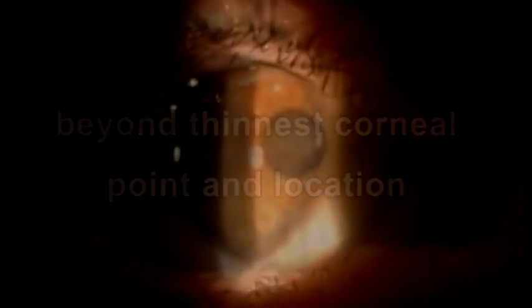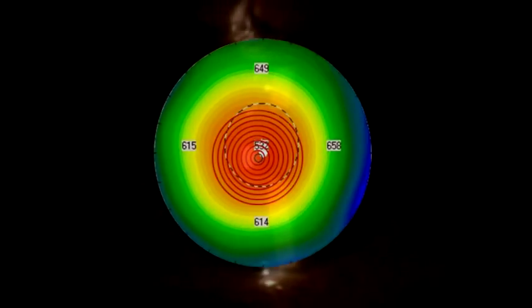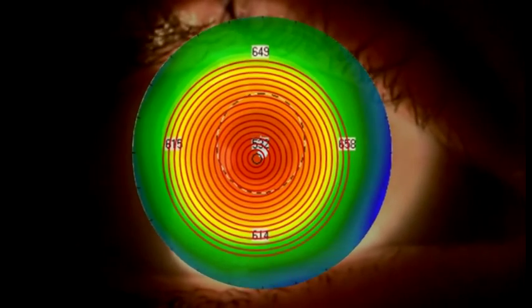Beyond thinnest corneal point and location, thickness distribution is described as average thickness values in concentric annular circles with increasing diameters centered at the thinnest corneal point.